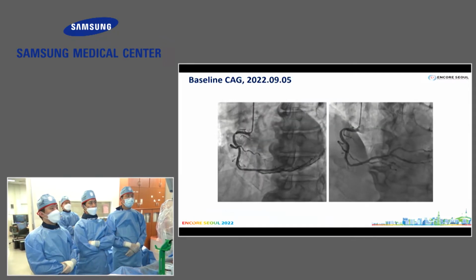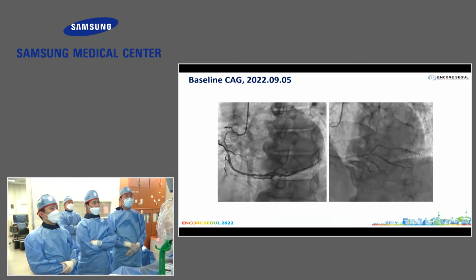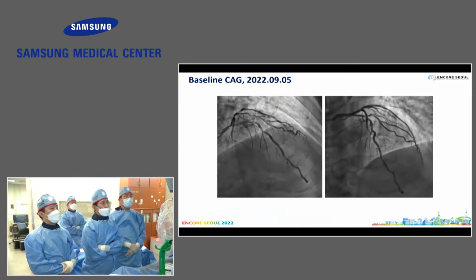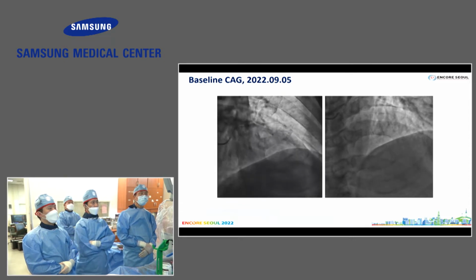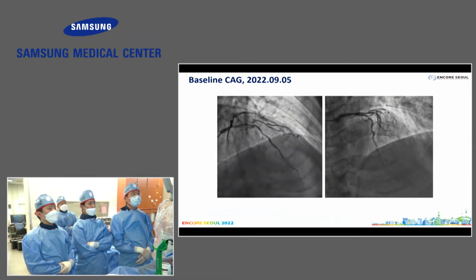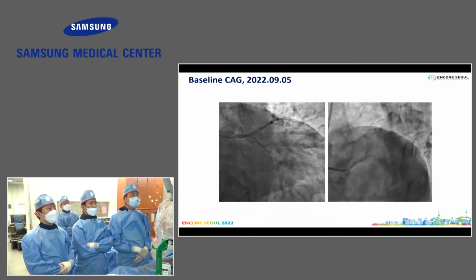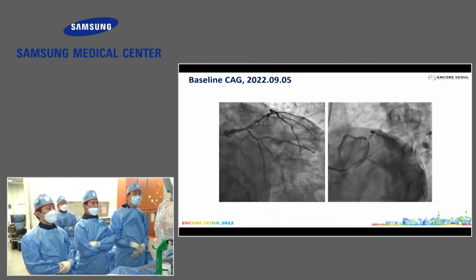Next. Coronary angiography showed a relatively normal looking right coronary artery. And left coronary angiography showed significant stenosis in the proximal to mid-LAD, with stenosis of the ostium of the diagonal branch that looks significant. And the AP caudal view showed focal tight stenosis of the circumflex ostium.